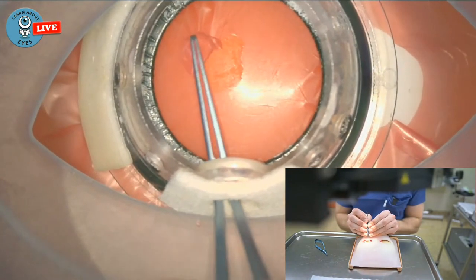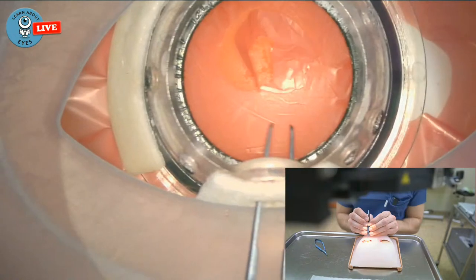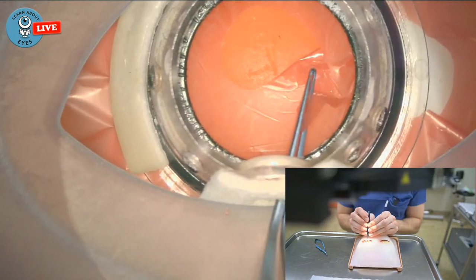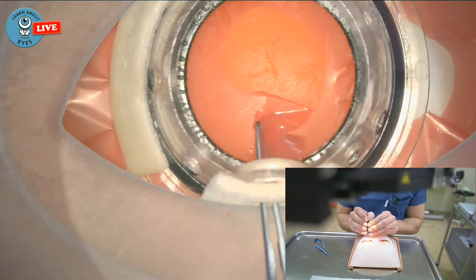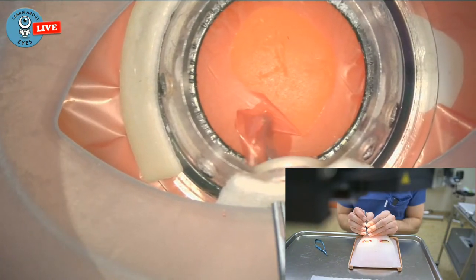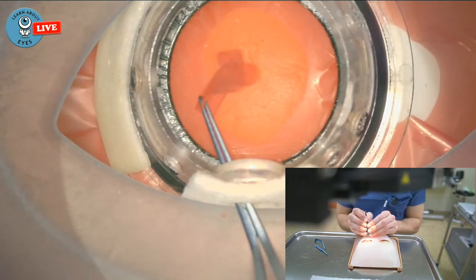All right, so let's go the other way around once, just to practice it. This is exactly the time to do unnatural things, things that don't feel good to you. Need to be practiced. And you see I have trouble grabbing like this, and I'm twisting it. That can't be good. There we go. It's going out, so I'm pulling it back in. Oh, by the way, this is perfect to practice pulling it back in.